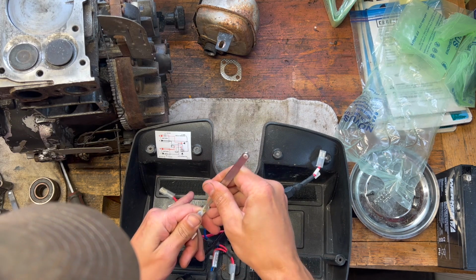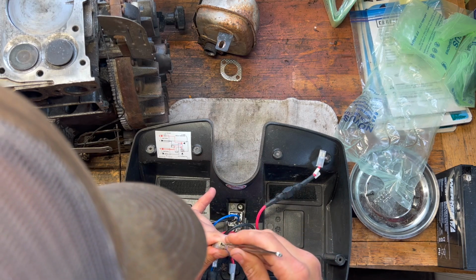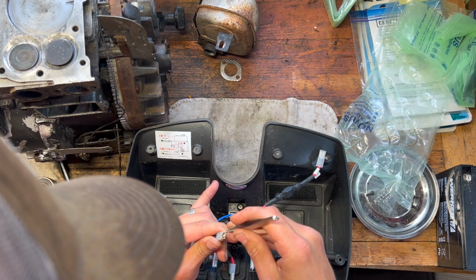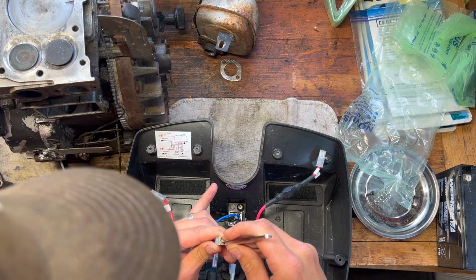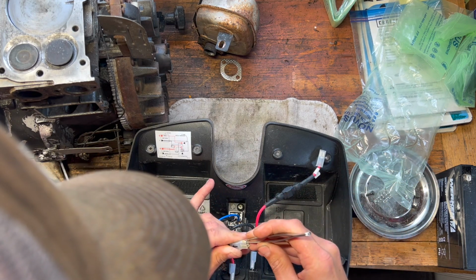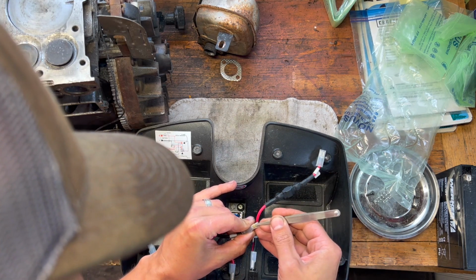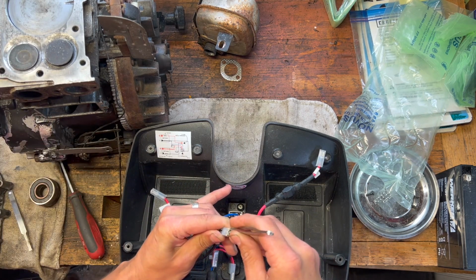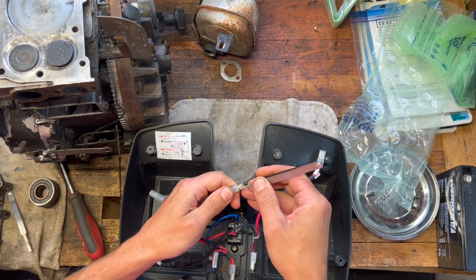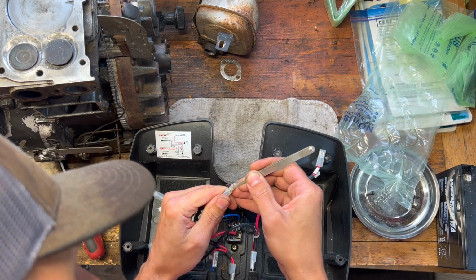Obviously this doesn't take into account the drive motors or anything. This is just step 1 to get power. I couldn't figure out a way to really bypass the batteries to test the electric motor. I don't know, there might be 1 or 2. I don't know if each wheel or each side has independent motors, like a skid steer, or I think like an actual powered wheelchair has independent motors. But I'm not sure if this would or not.